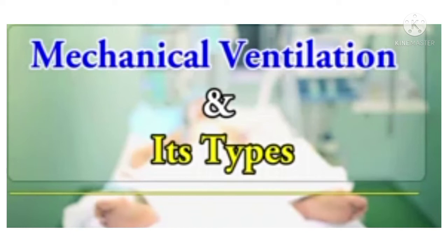Volume ventilation: with volume ventilation, a predetermined tidal volume, VT, is delivered with each inspiration, and the amount of pressure needed to deliver the breath varies based on the compliance and resistance factors of the patient ventilator system. Consequently, the VT is consistent from breath to breath, but airway pressure varies.